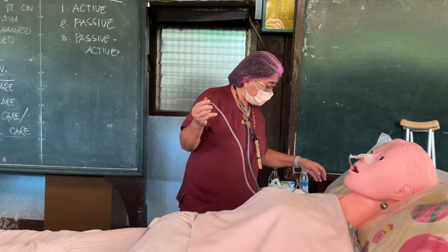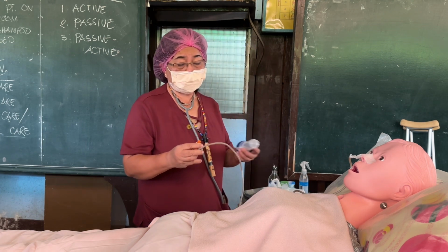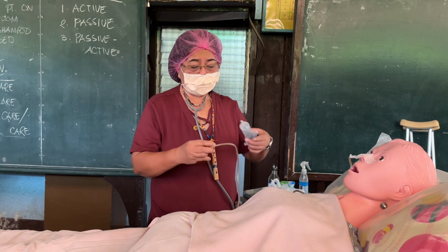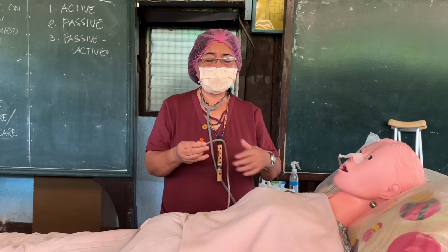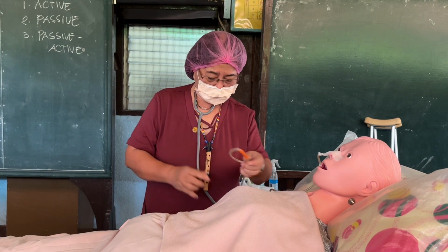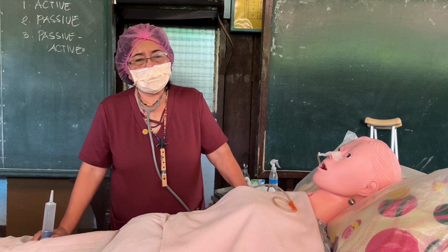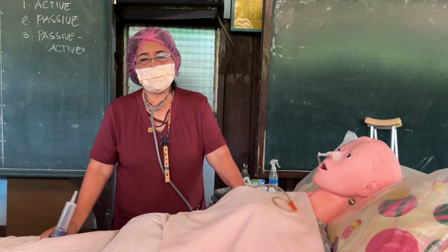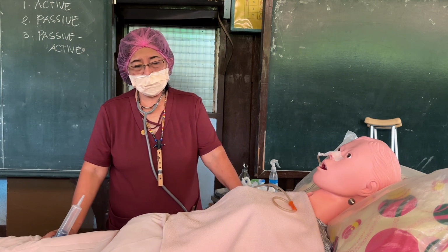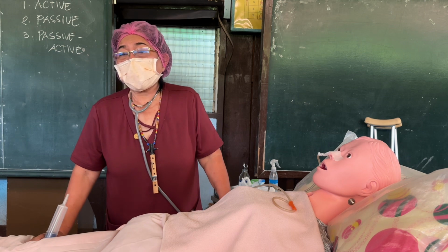Okay, confirm again with the 5 ways to confirm that the NGT is really in the stomach. We put the syringe. Physician's order: flush and irrigate NGT with 1 liter of PNSS until return flow is clear.